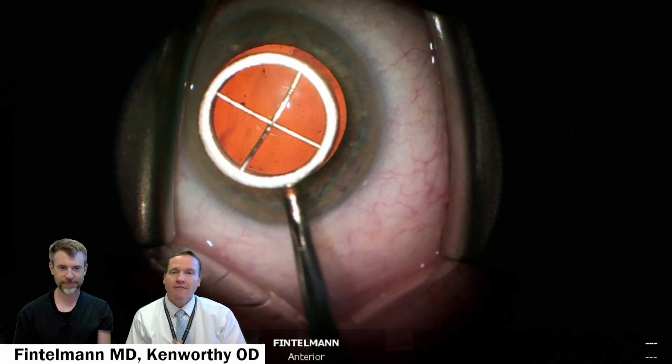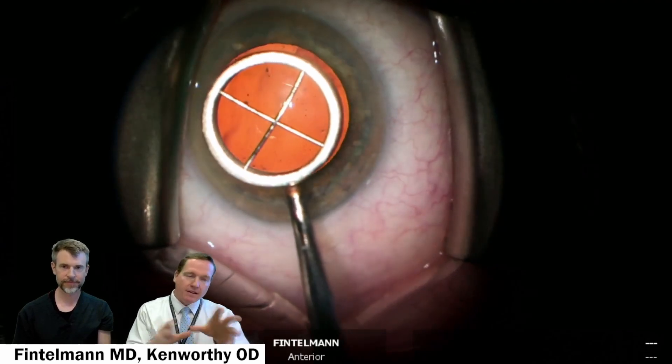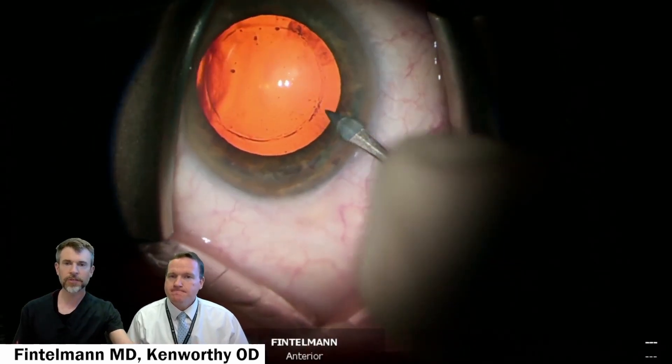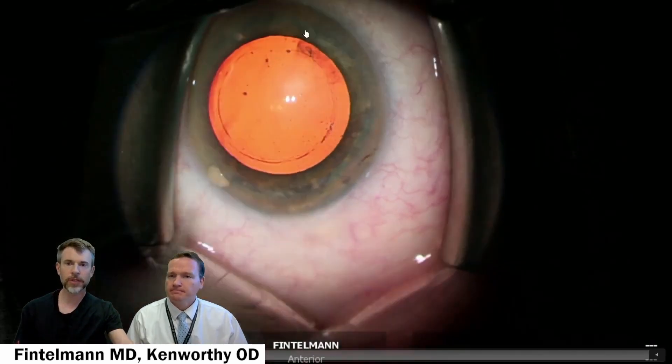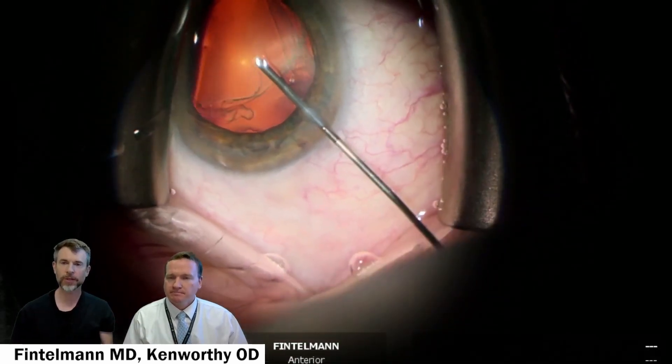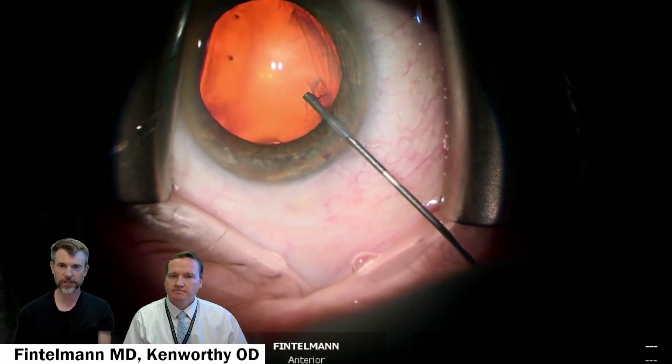We want to look at one more cataract surgery and take a look at some of the nuances with this one compared to others we've seen previously. And importantly, this is just an imprint — it will be gone by tomorrow. It's literally just a little indentation on the epithelium, but it stays long enough so that I can perform a capsulorrhexis of that size.